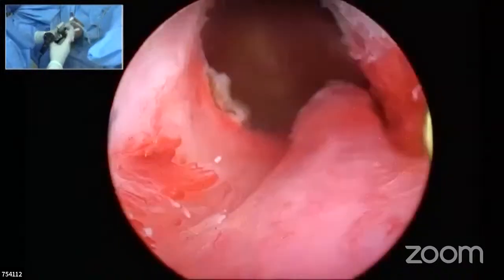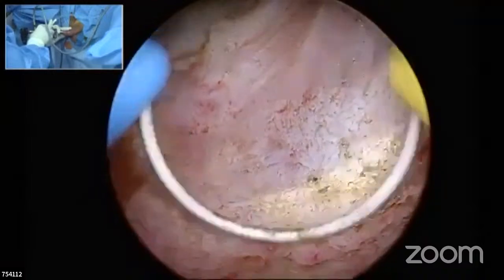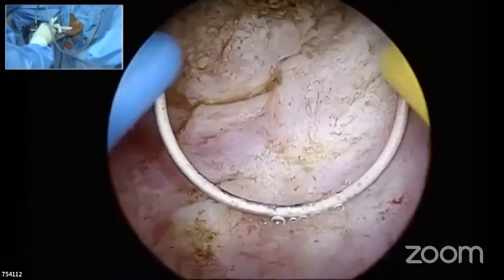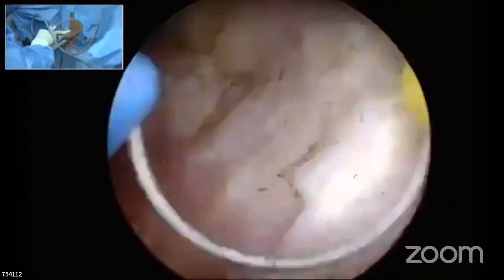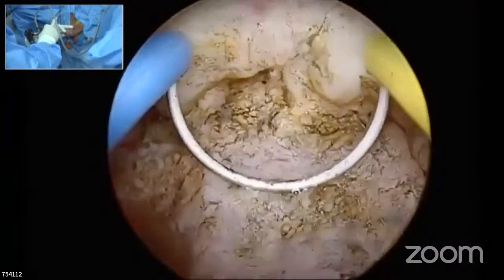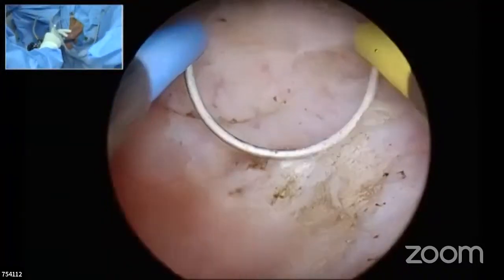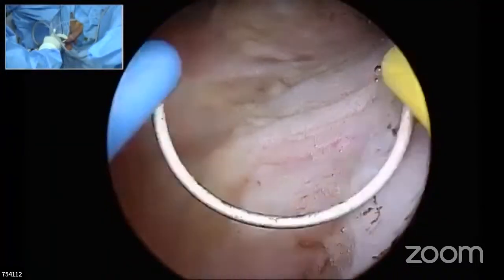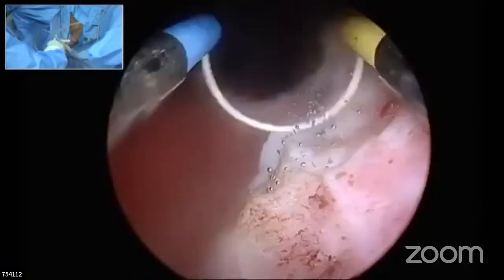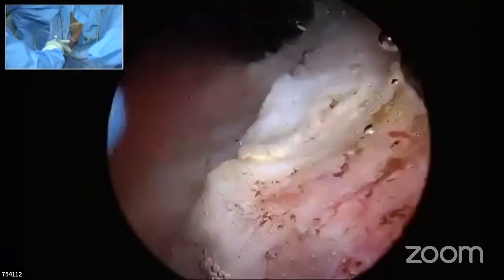Now, are you happy with the whole resection? Yeah, we hope it was a very good demonstration. There is no doubt. And it is good that Mallikarjun is showing intermittent also, so that the delegates also know, because this has been our technique too until we started using the continuous suction irrigation system. Let them be exposed to as many techniques as possible.